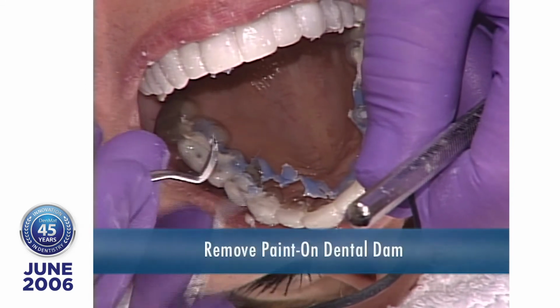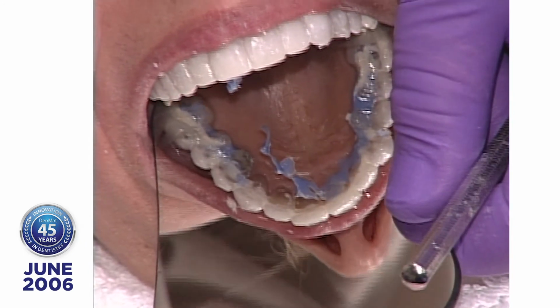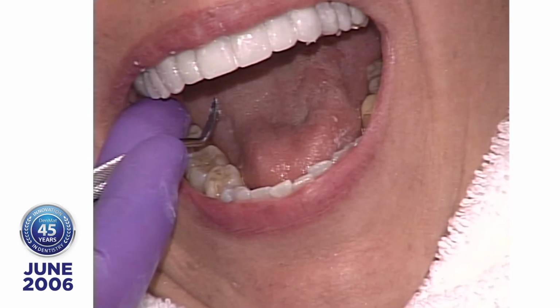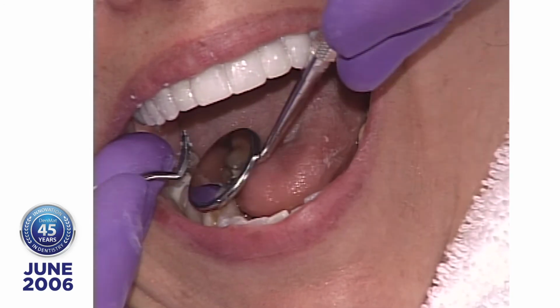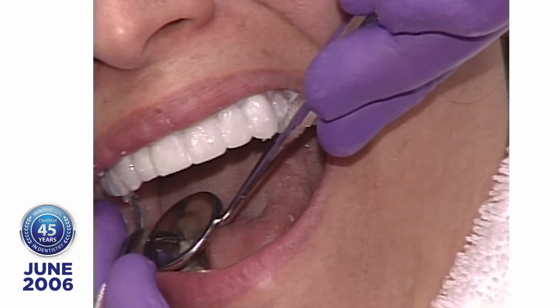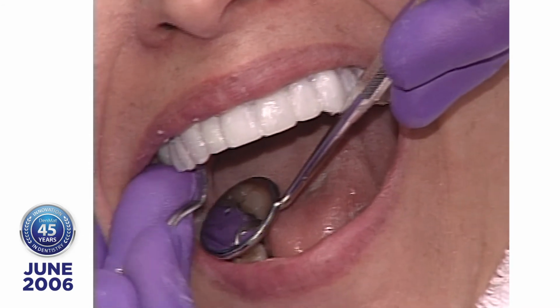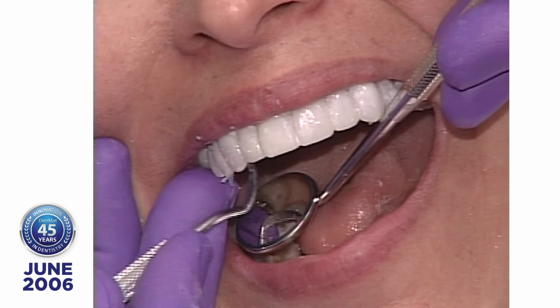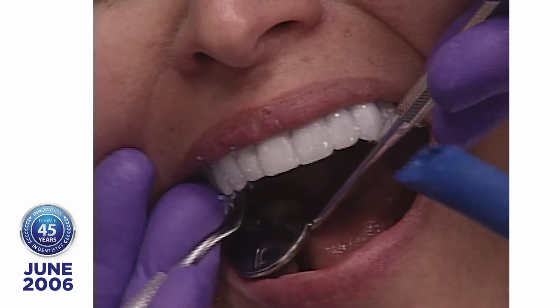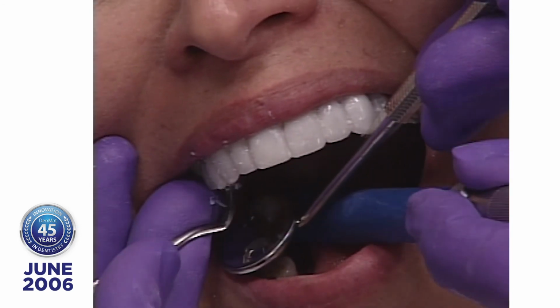Okay, now we'll go on the lingual side, open, and we'll start picking off. Mirror. Somebody asked me why I didn't want to polymerize these all the way on the paint on dental dam. See how it starts popping off like that? Can you see that? And look how dark those teeth are underneath. It's hard to remember, isn't it? Because I had the paint on dental dam, that big chunk mounted to that molar just came off relatively easy. Paint on dental dam on the occlusal surface of bicuspids for the same reason as I put it on the lingual. It makes it easier to get the Ultrabond off the occlusal surface.